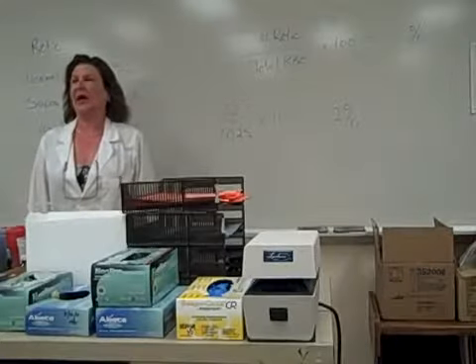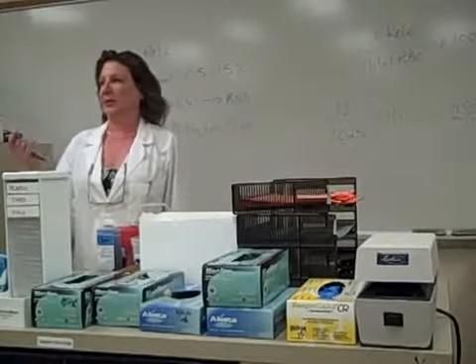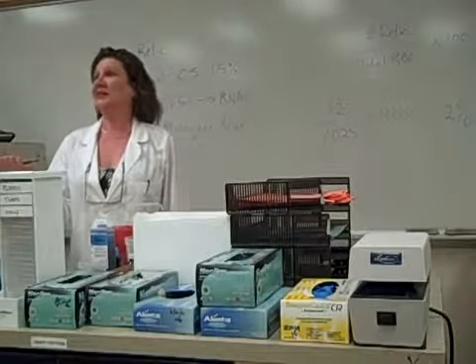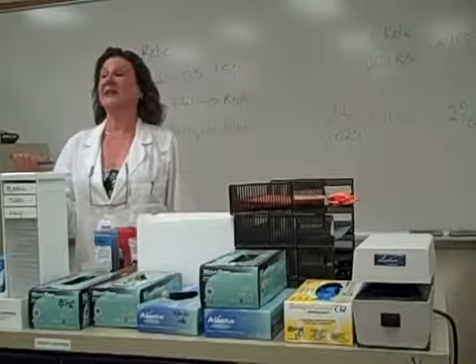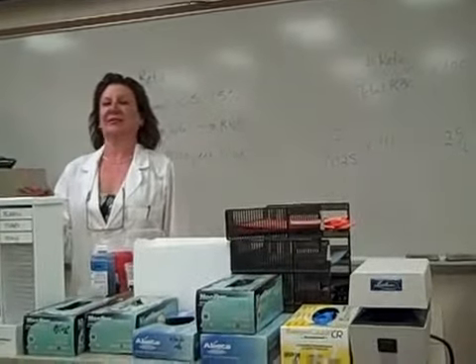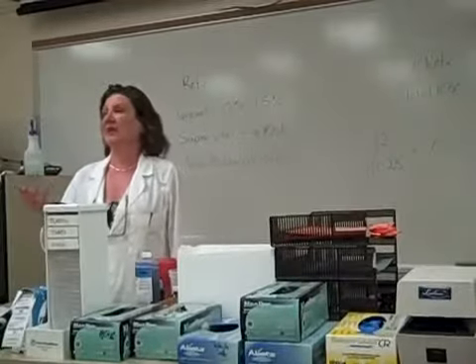Yeah. Okay. In a few minutes, we'll sit down at the scope and I'll show you Dorothy, okay, who was actually one of my students' grandmothers that went in the hospital. She had a lot of blood loss. Her retic count is about 20%, so it's awesome to look at. So we'll look at that together and I'll show you what a retic looks like.